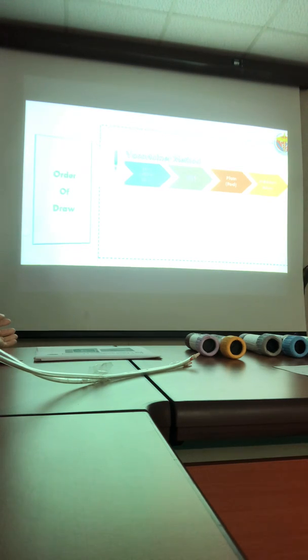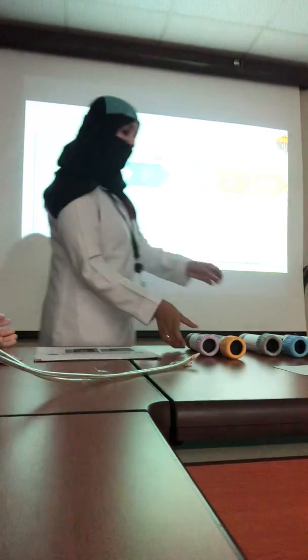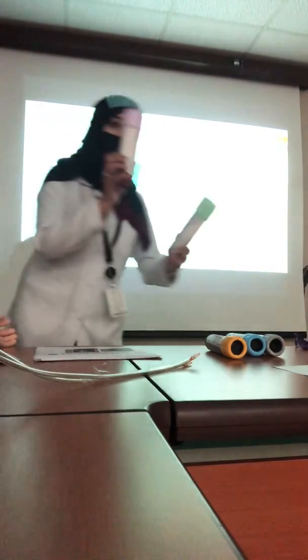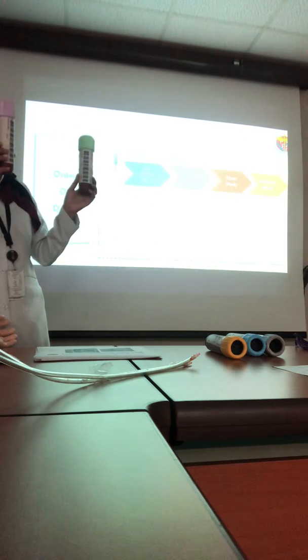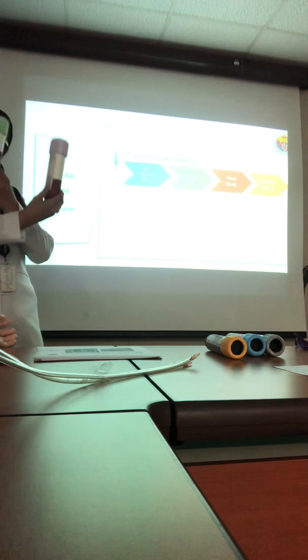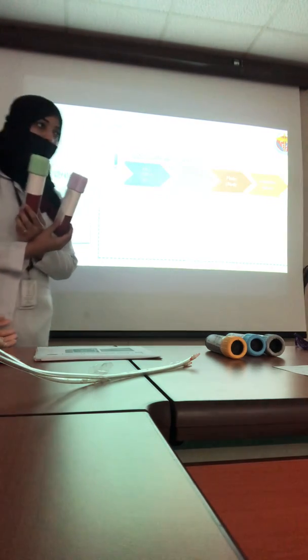Because first, aseptic technique, for example in the blood culture, the first one you have to do is the blood culture. Yeah, first, of course. Then you will follow the next one until it will be the green or EDTA first? Green. Why? If I extract the EDTA before the green, what happens? This one we don't know.